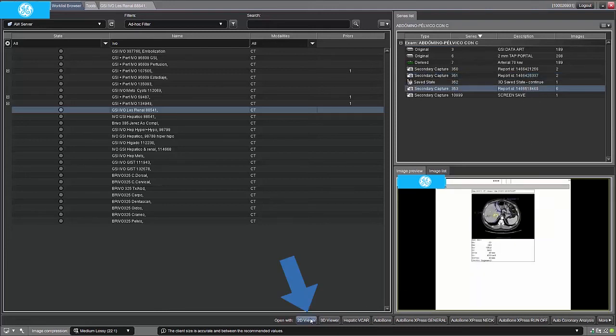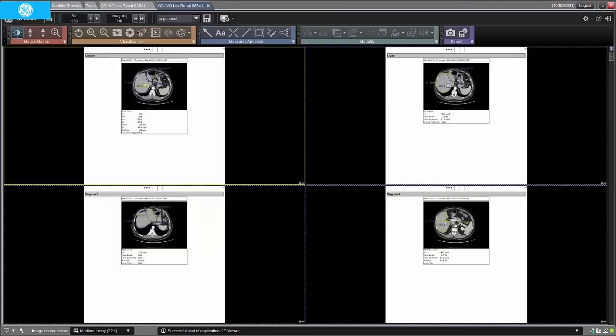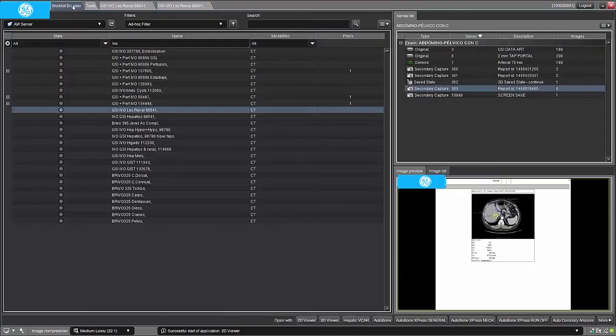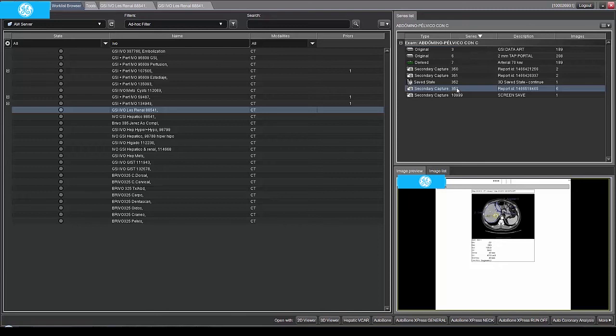We can review the results in the 2D viewer. We can also export the data to PACS or other archive destinations. Thanks for viewing. In the next tutorials we will cover Portal Vein Segment Separation Mode and VR Compare.